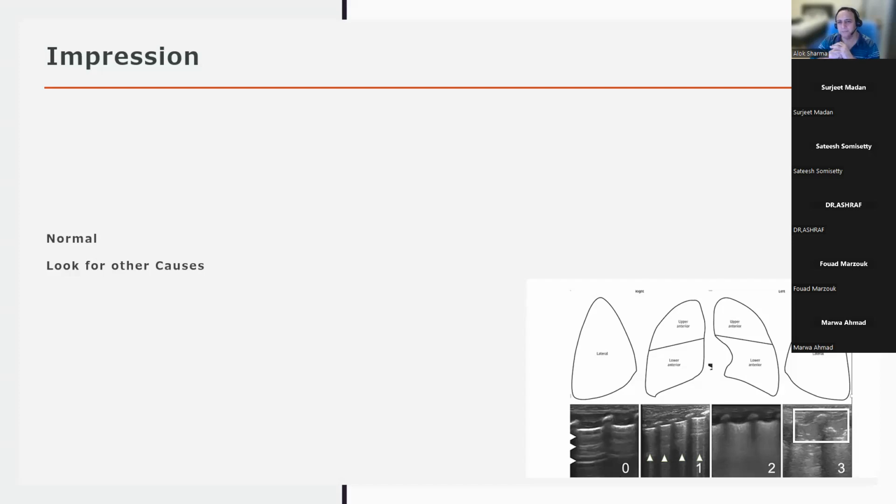Dr. Alok: Is the scoring for the posterolateral different or the same? It's exactly the same score. So you use BRAT's score with the baby prone, and you're doing R5, R6, L5, L6, the lateral zones. Now it's a very large area. So my advice would be that I usually scan the entire area laterally, and I take the worst score. Yes, that's what happened.